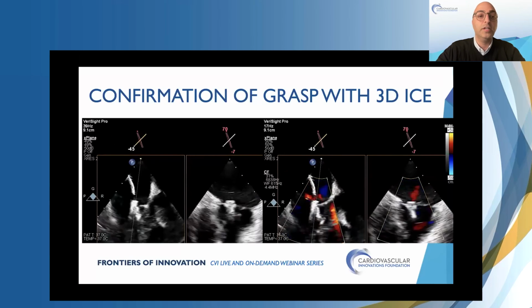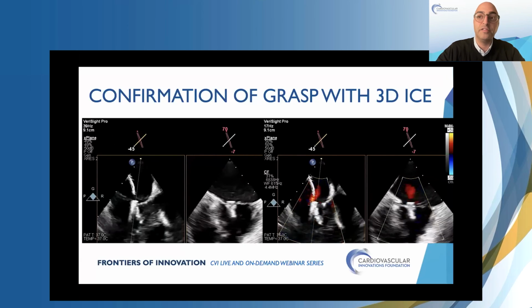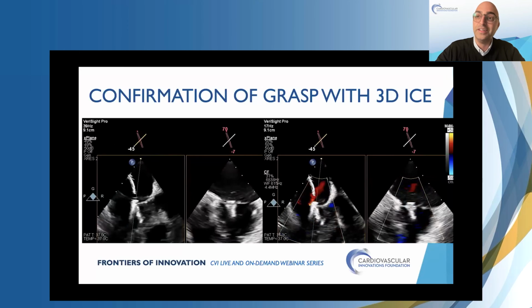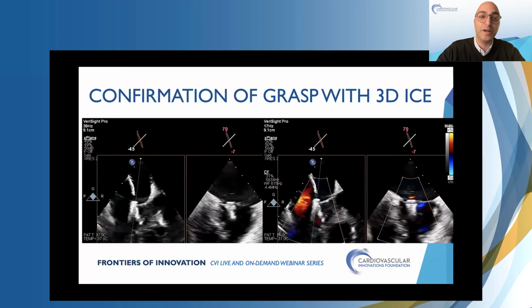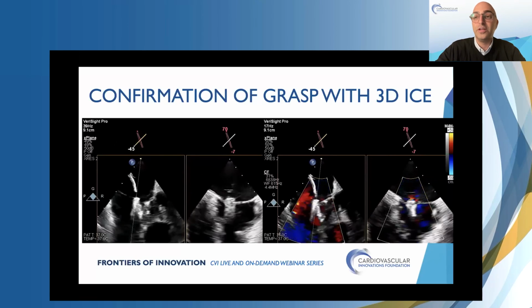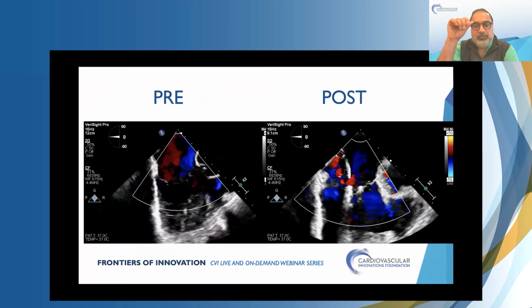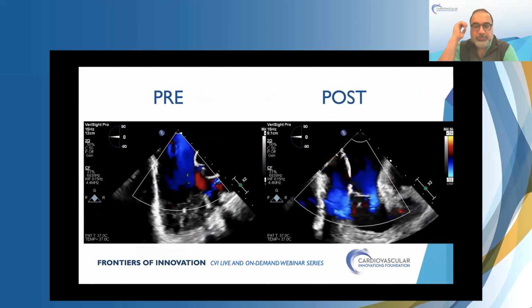Same thing with TE, which is you don't always have to be 90 degrees off each other. It's not always -45, 45. You can make that right image whatever angle you feel like. So you can just change that omniplane to whatever you feel like. We were at -45, 45, and I just changed it to 70 to actually see our grasp view a little bit better. But to Lynn's point, you do it methodically with a 3D navigation, and it's not just a bunch of trial and error stuff.